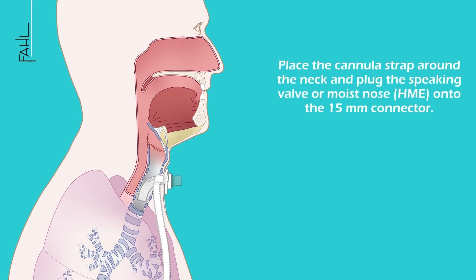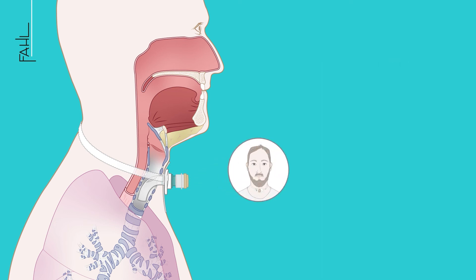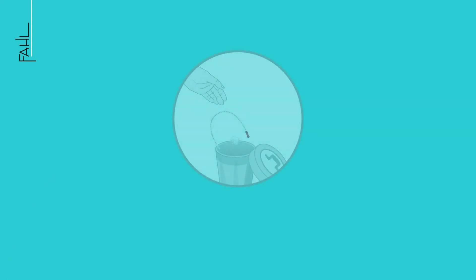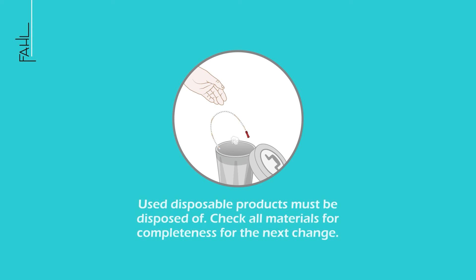Place the cannula strap around the neck and plug the speaking valve or moist nose HME onto the 15 mm connector. Used disposable products must be disposed of. Check all materials for completeness for the next change.